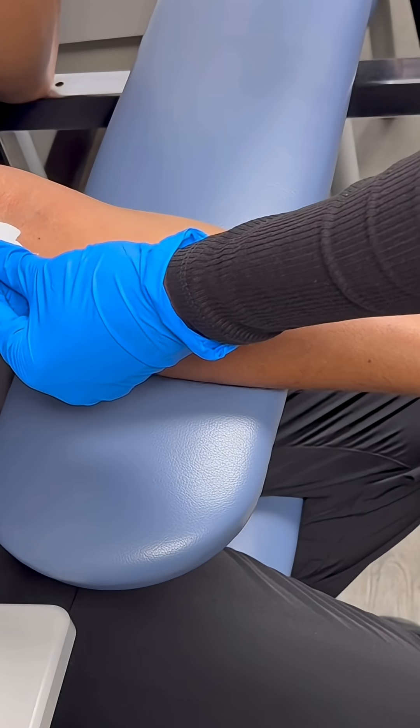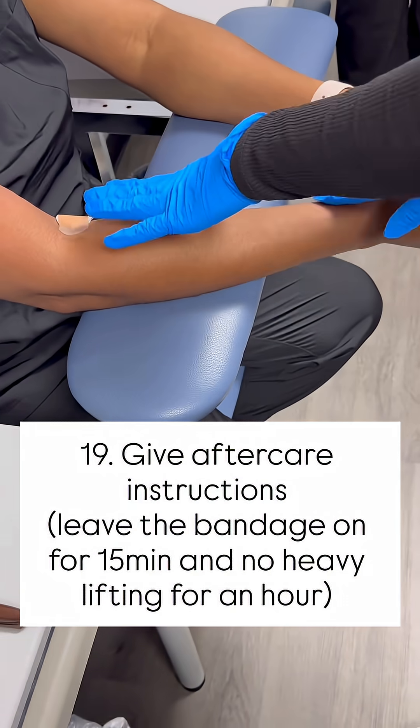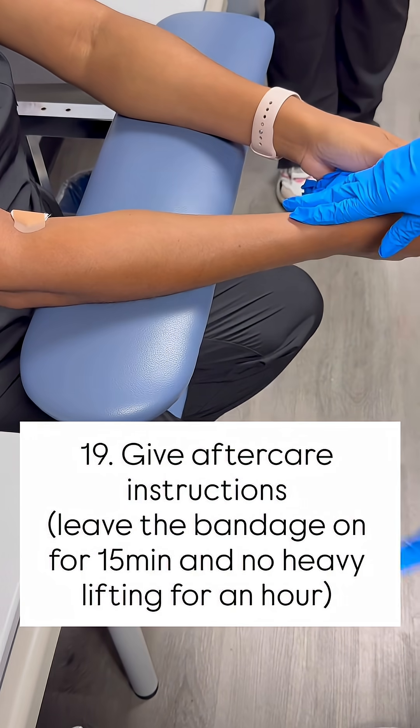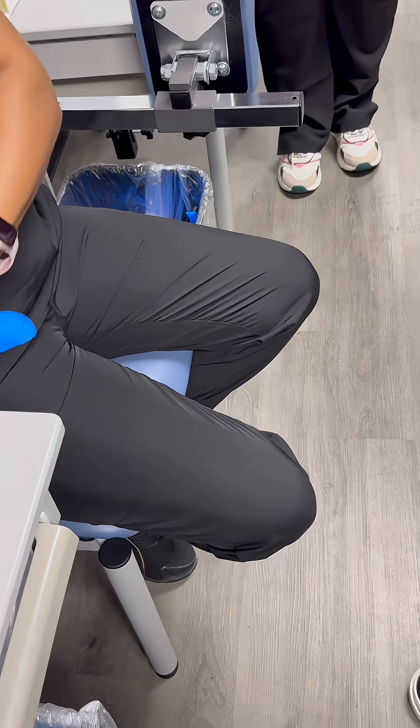She verified her name and date of birth. I'm going to check her site to make sure it has completely stopped bleeding. I'll hover the gauze back over there and then say: leave this on for about 15 minutes, and no heavy lifting for an hour. And then you're all set.